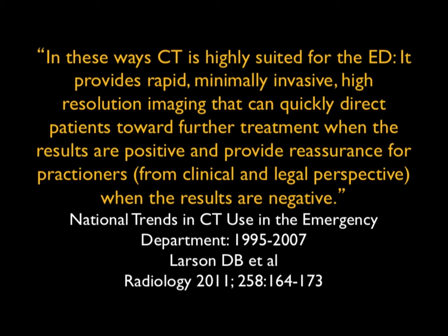Another important thing is when people speak about the value of CT or criticize CT is that people often talk about, well, the study was negative. Well, you know very well, a negative study is not a non-important finding. If a patient has acute abdomen or symptoms suggesting acute abdomen and the CT is negative, the likelihood is the patient has nothing or it has enteritis, but is nothing of any significance. So you can't really say that a negative study is a not necessary study. Sometimes saying normal is the best thing.